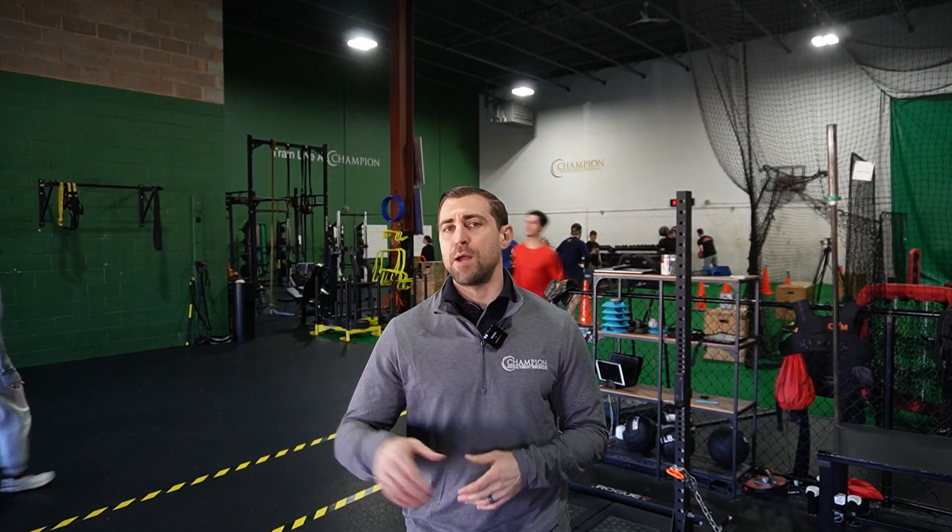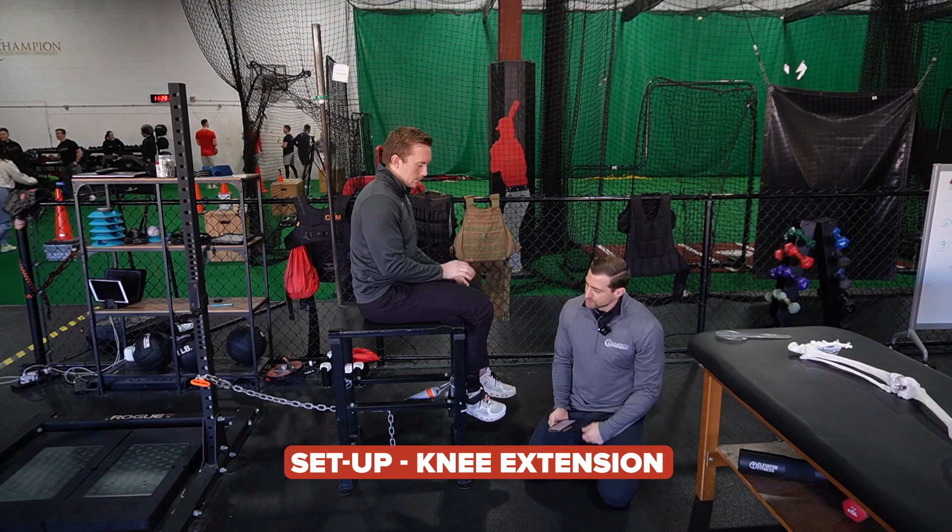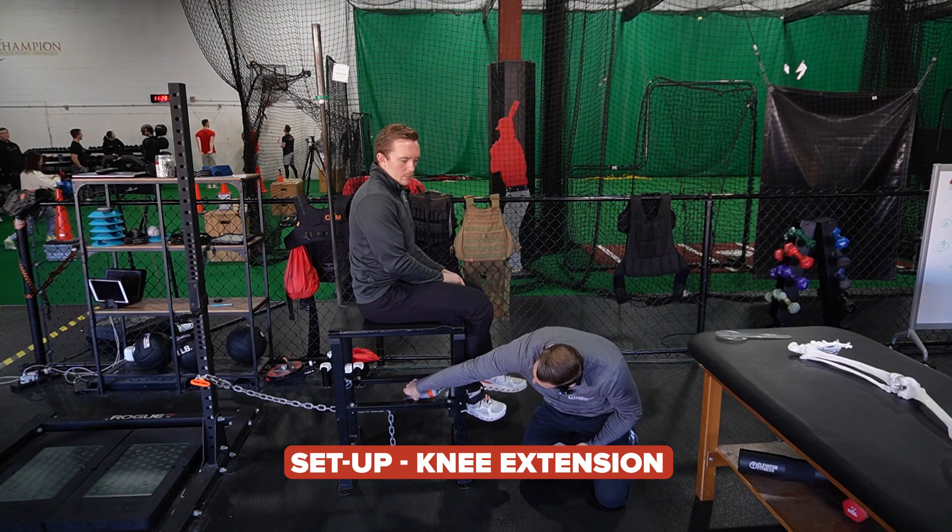So let's say an athlete has a very weak quad but their hamstring is fine — you spend more time working on the quadricep. Maybe it's flipped: the hamstring is weak and the quad is very strong, so we don't have to worry as much about the quad and can focus more on the hamstring. So we're going to talk about knee extension first — measuring the quad. We're using a Vald Dynamo, a handheld dynamometer.